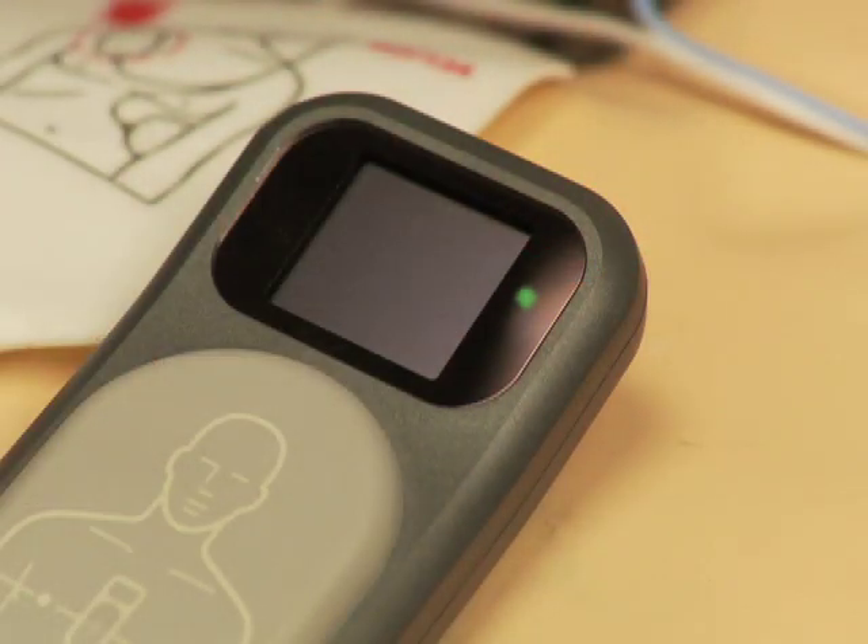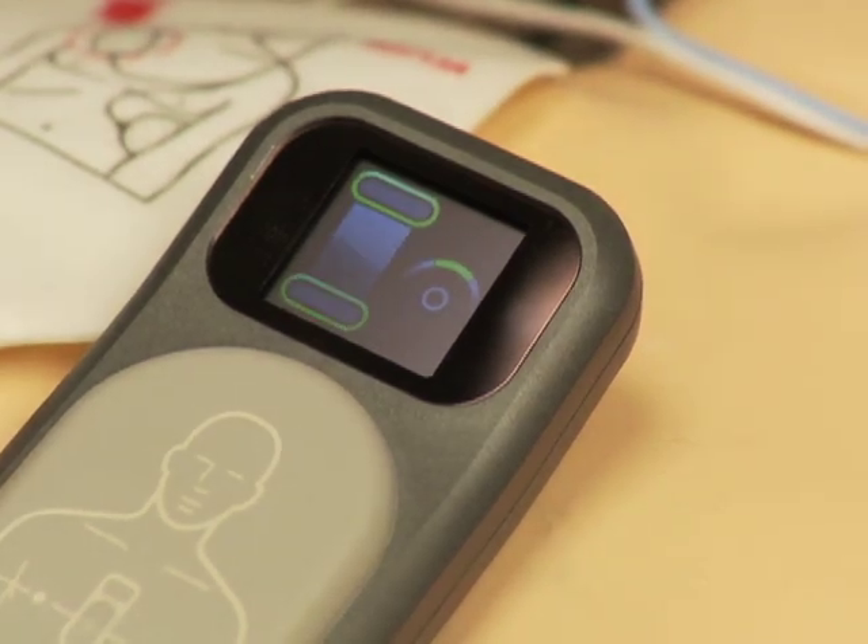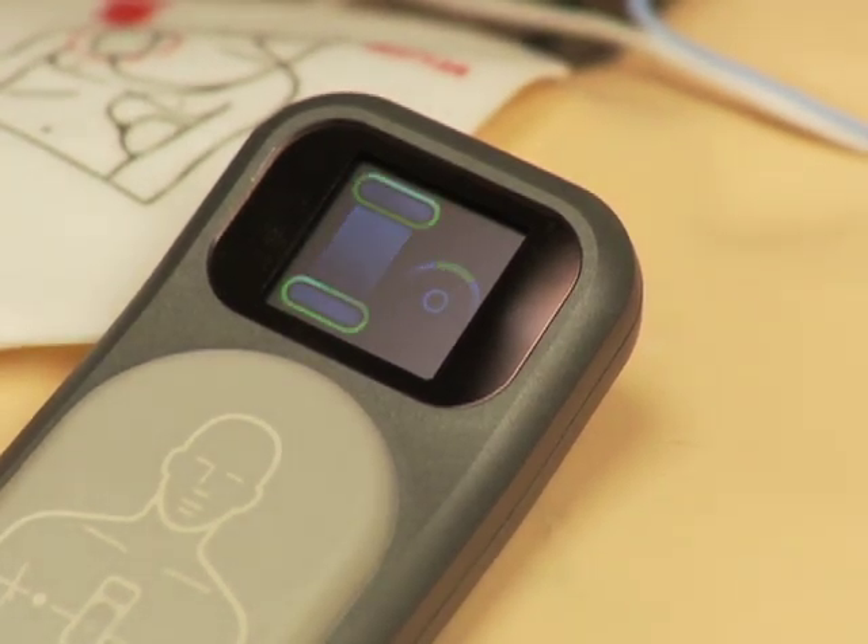A status light on the CPR meter remains off when the meter is connected but the HeartStart MRX is turned off. When the MRX is turned on, the status light becomes green to indicate that the CPR meter has passed its self-test.